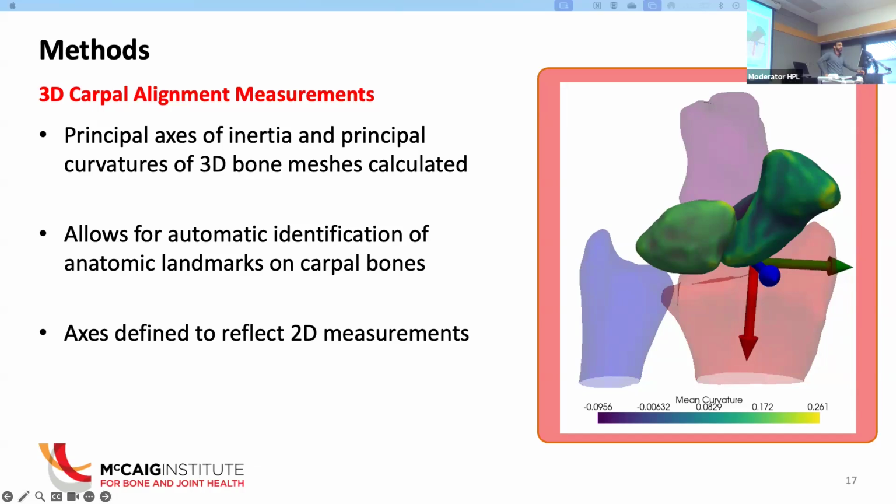Okay, one more quick. When you put the patients in the loaded positions, are they quite uncomfortable? Like, do they say, I can't do this, I don't want to do this? The healthy individuals didn't have many problems. I wasn't here for all the data collections, but from what I understand, there weren't any problems.